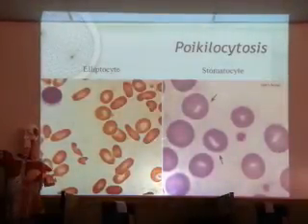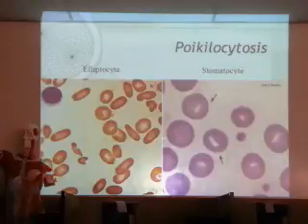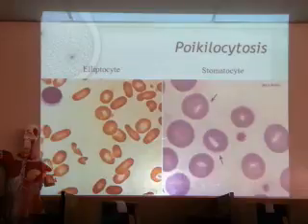And other pretty rare conditions. Elliptocytes. Red cells should be nice and round, but sometimes by genetic defect, the cell membrane proteins are arranged in a different way, so you end up with these elongated red cells we call elliptocytes. Here's a small normal lymphocyte for size comparison, so they look a little bit smaller too.